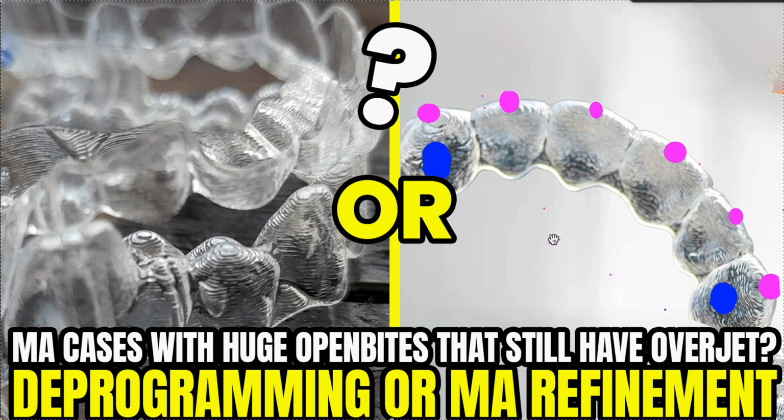So now I feel like I'm knowledgeable enough, and I'm trying to explain to you guys that we're all knowledgeable enough to let the patient know that the ClinCheck and what it looks like is not really what's going to happen. It's not just going to sail through your numbers and go to TB and go to TG, and then it's going to be perfect. No, you're going to have at least one or two refinements. You're going to have to do some type of deprogramming or elastics or extrusion attachments, and it's going to be clunky and junky.